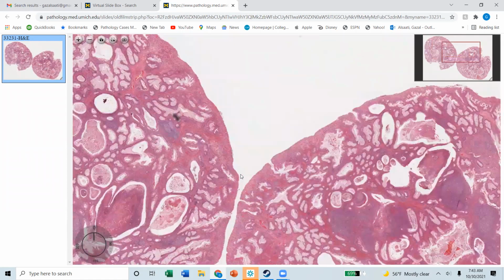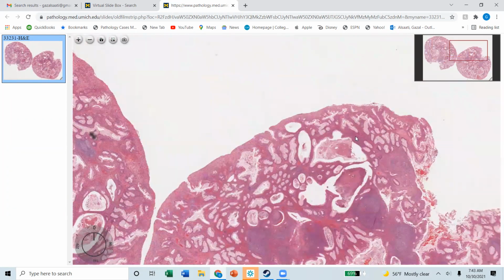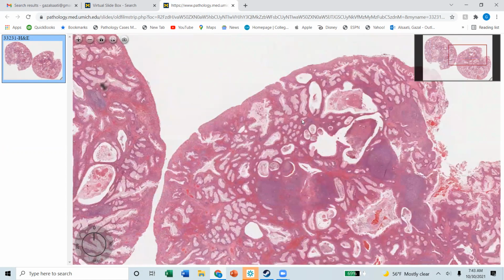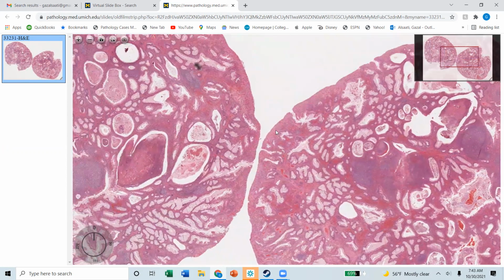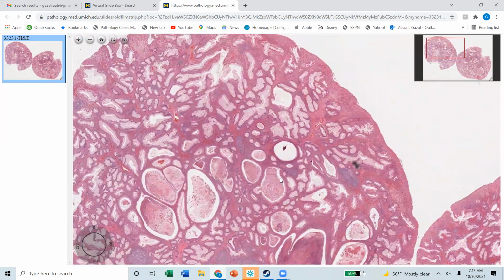It has to be a nice, smooth surface. Otherwise, if you have the papillae coming up and down and the serrated changes, you're dealing with a hyperplastic polyp, or you're dealing with a serrated polyp. This one is cystically dilated because the lamina propria around it got swollen and inflamed and started pulling the glands in many directions and changing their shape.